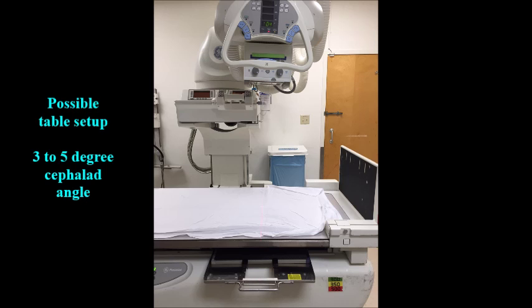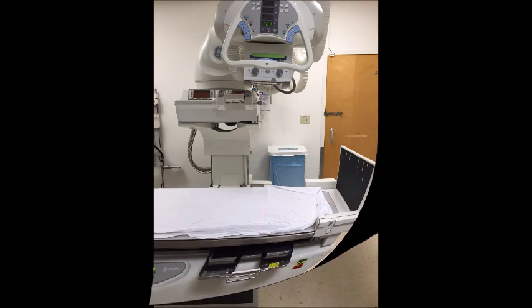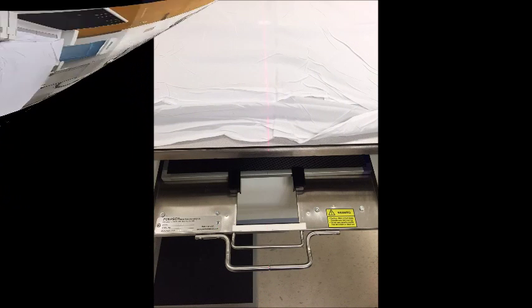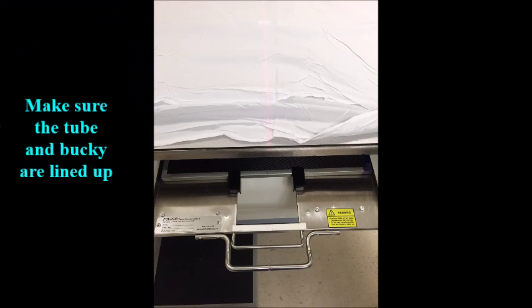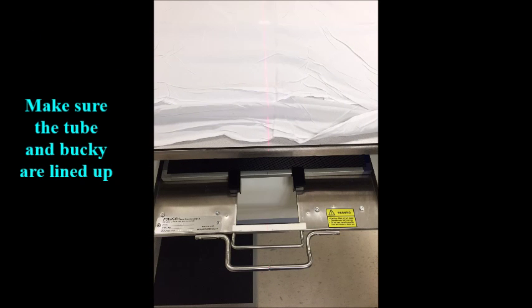This demonstrates your 3-5 degrees cephalad angle of the tube. This also demonstrates lining your tube up with the bucky.